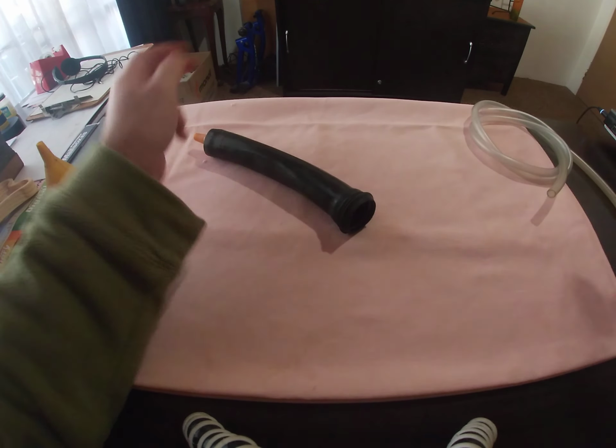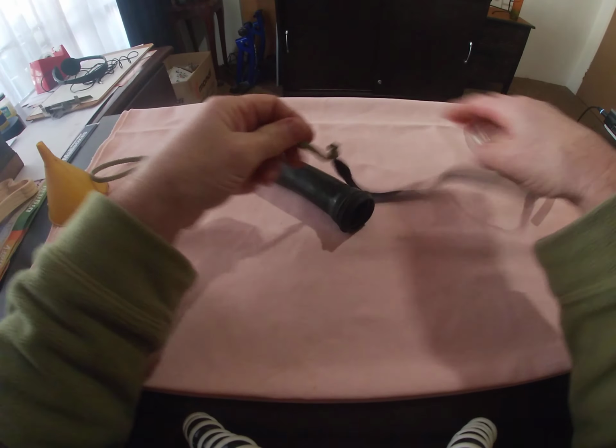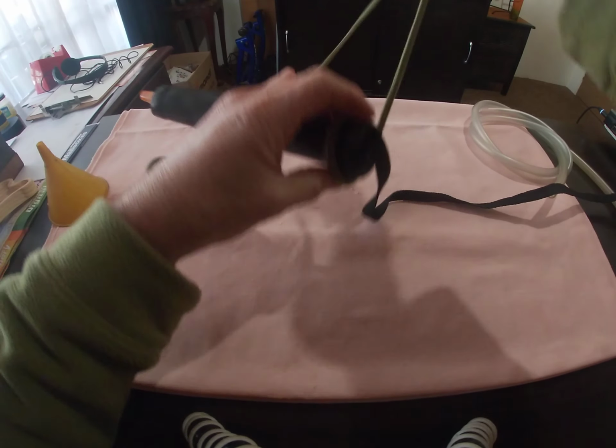And the last thing that you're going to do, you're going to take your shoelaces, or if you can get a piece of string that's soft enough, and you're going to loop it around you.